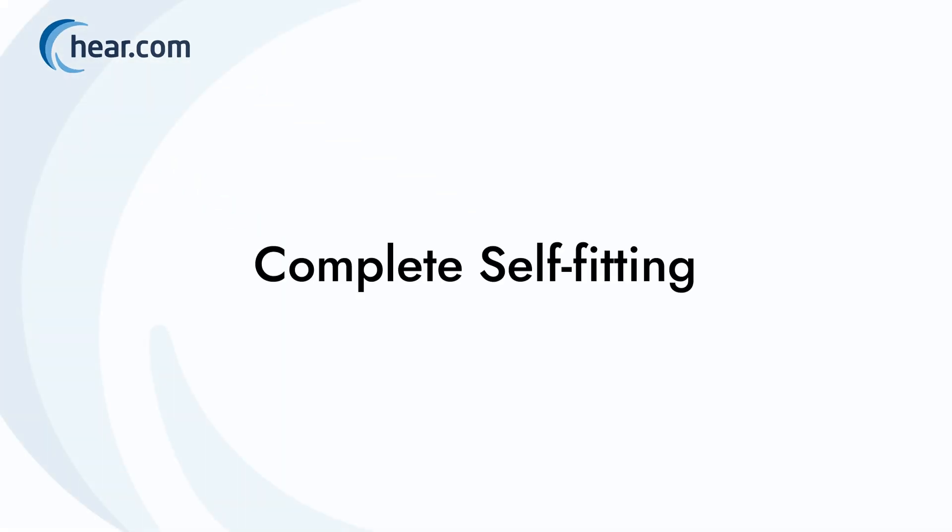This video will show you how to adjust your hearing aids to your individual hearing loss from the comfort of your smartphone. So let's get started!